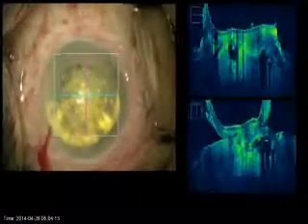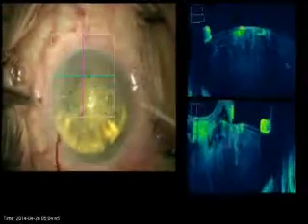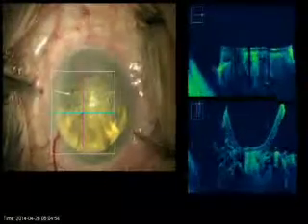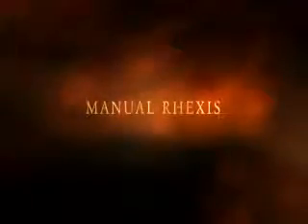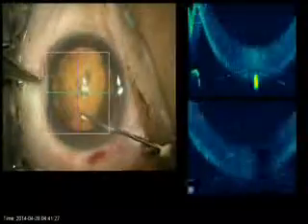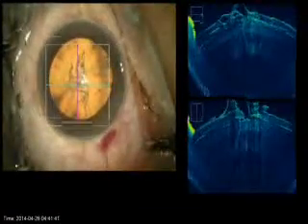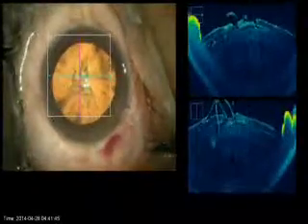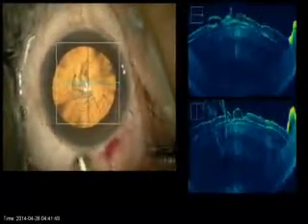It was interesting to see that the femtosecond-assisted capsulotomy caused superficial cortical disturbance. Superficial cortex adhering to the anterior capsule can be seen in the OCT image to the right of your screen. On the contrary, the manual continuous curvilinear capsulorhexis caused minimal cortical disturbance. This can be seen as a hyperreflective, folded structure, without superficial cortical matter, on the top of the real-time OCT image to the right.